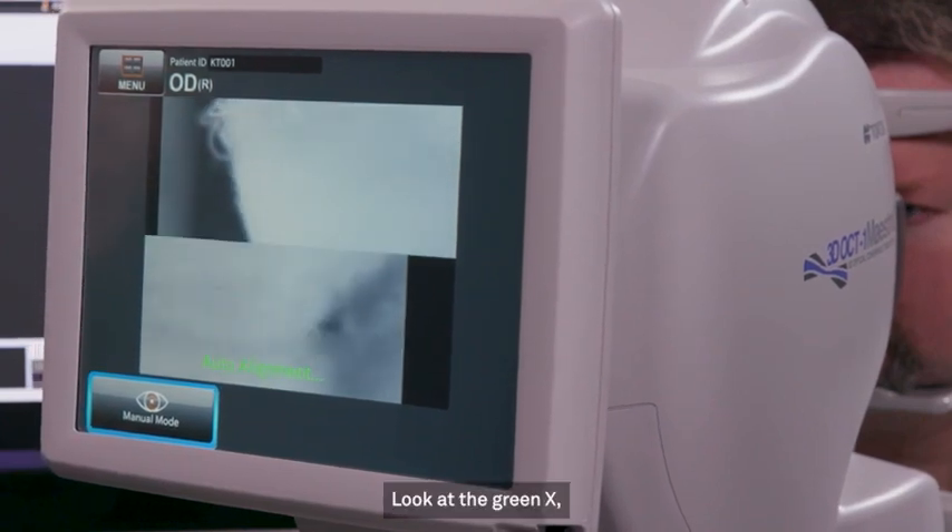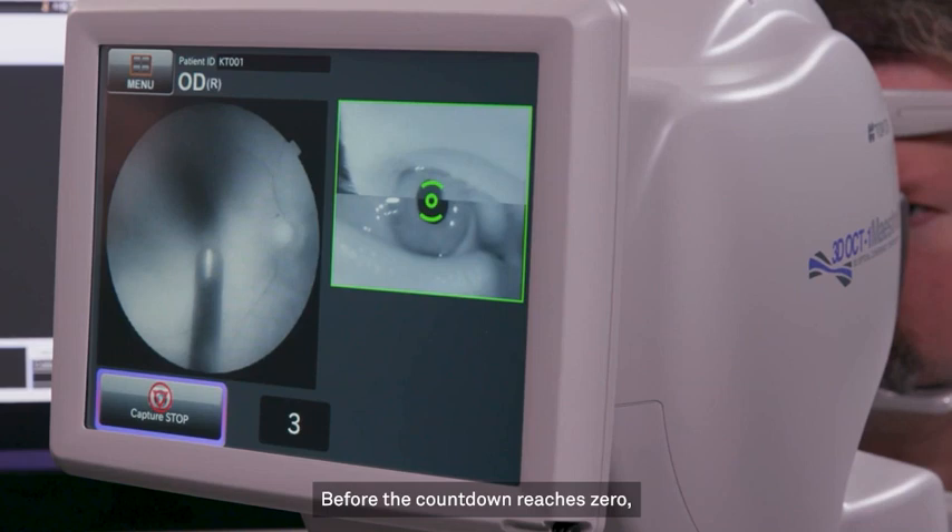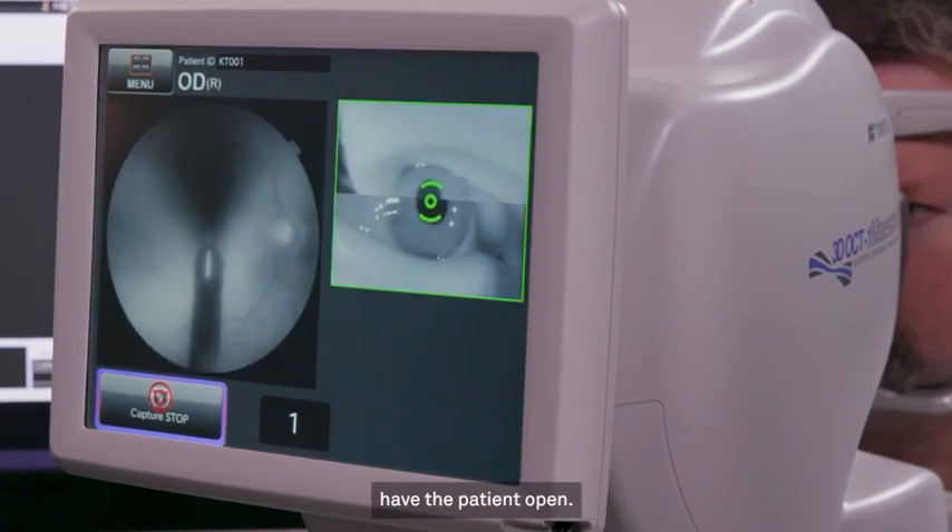Look at the green X. Blink normally. Before the countdown reaches zero, have the patient open.